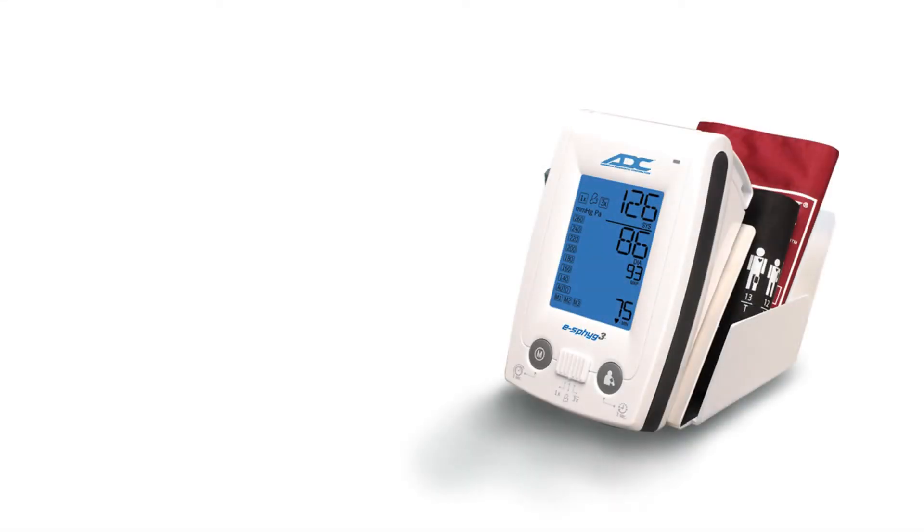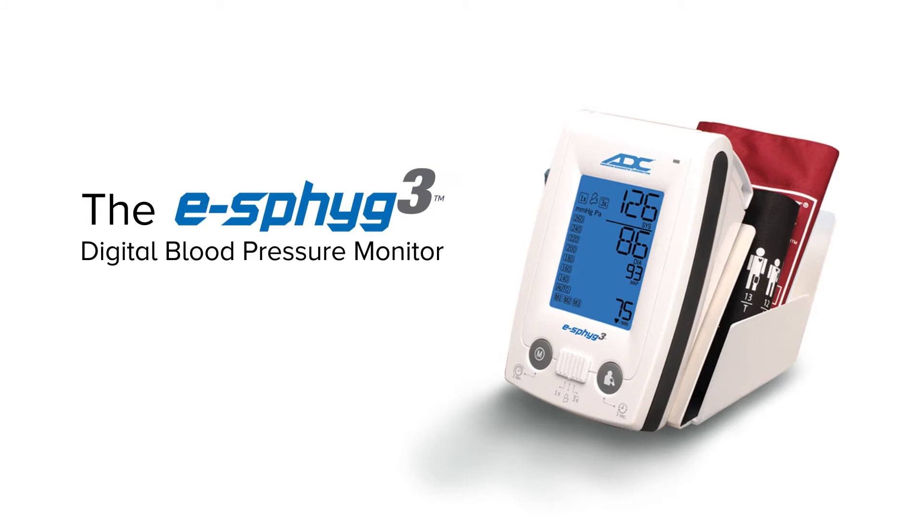ADC's all-new eSFIG3 is a feature-packed, professional-grade NIBP monitor with three clinically validated modes, including Single Measurement Mode, Customizable Average Mode, and Manual Mode.